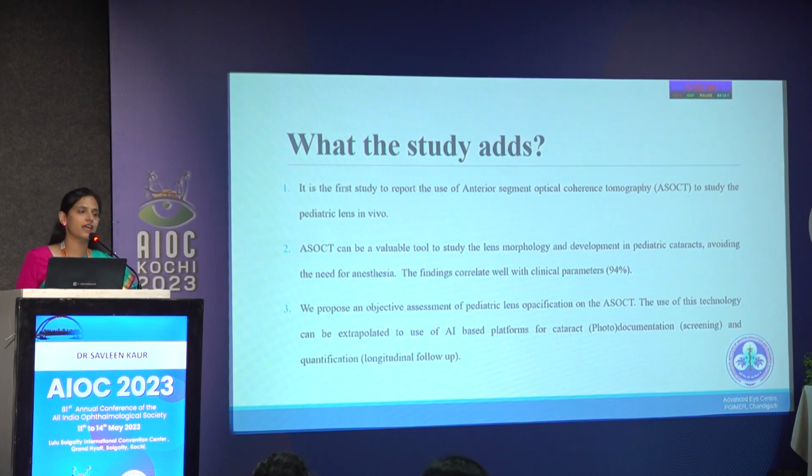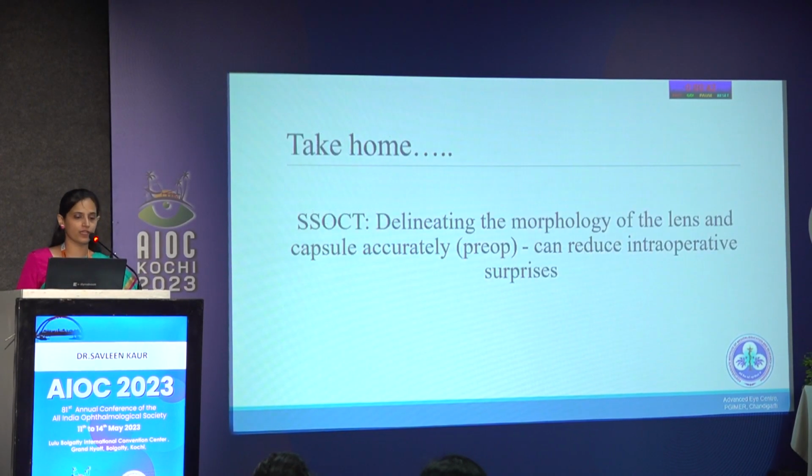And also there might be scenarios like diabetic cataracts or steroid-induced cataracts where you need a follow-up and a quantification might come in handy. So it helps us in delineating the morphology of the lens and the capsule, and it can reduce our intraoperative surprises.